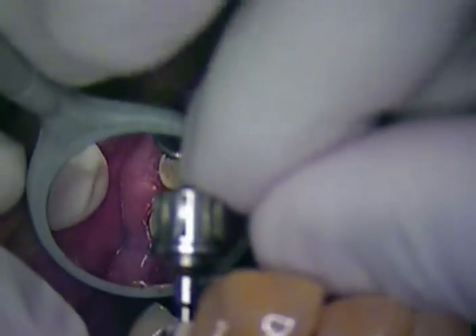So this is the one on tooth number 11. We did have cotton and wax — I'm just going to loosen them both first, with cotton and wax covering the openings. I noticed a little bit of gingival irritation on number 12, more so than number 11.